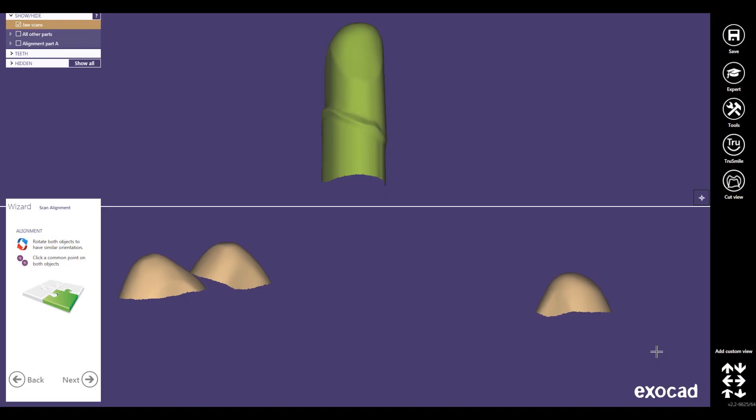Hello and welcome. My name is Michael Anger. In this video I would like to show you how we can use the Renishaw scan, which is a tactile scanner, for very precise surfaces for secondary telescopes.